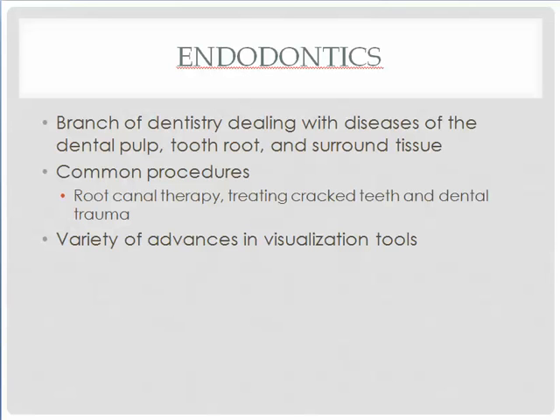Endodontics is a specialization in dentistry focused on dental pulp, the tooth root, and the surrounding tissue. They commonly treat cracked and decaying teeth and dental trauma, but primarily deal with root canal therapy, commonly abbreviated RCT. This area has been riddled with musculoskeletal disorders and has greatly benefited from advances over the past 15 years. New technologies and optical aids have caused improvements in ergonomic concerns as well as surgical precision.